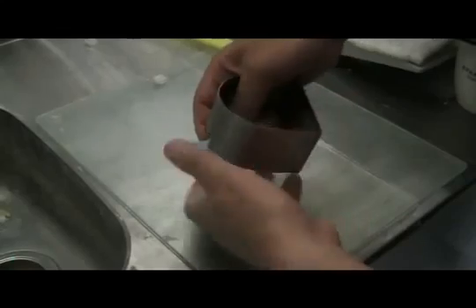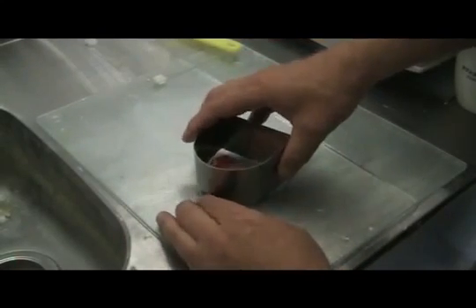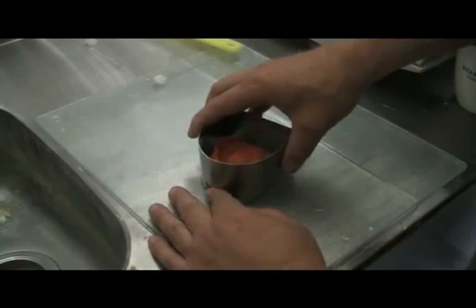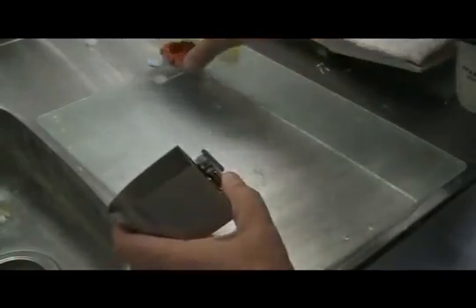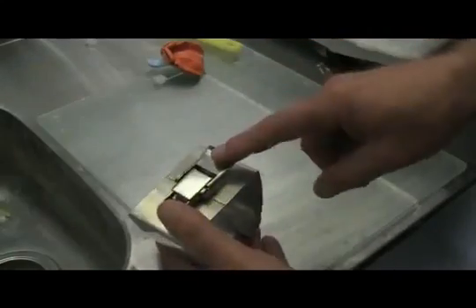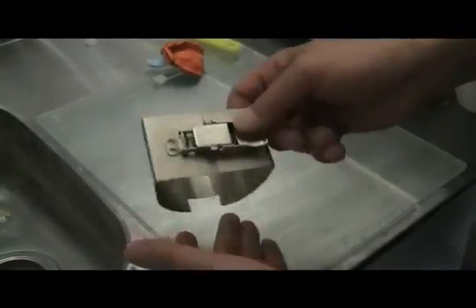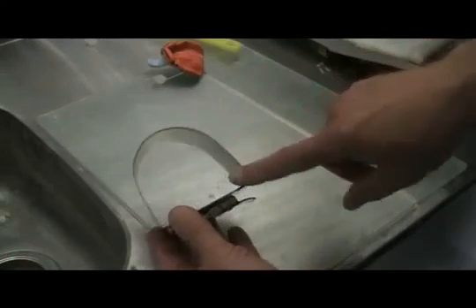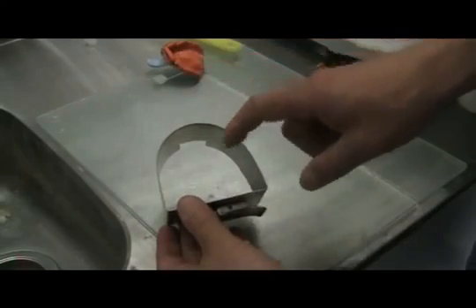So when you have this laid out and you have your impression placed inside the former, you don't have to be so concerned about the tray handle preventing a fair amount of space. The former also has a latching mechanism on the back, which is very nice, well constructed. It's welded right to the former itself. The closed and latched position generally accommodates most standard size impressions.